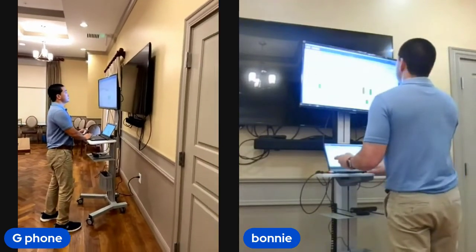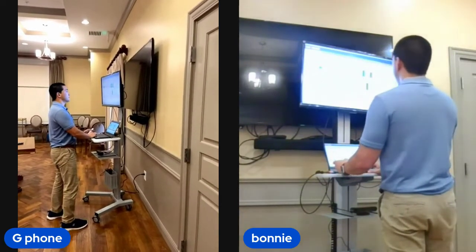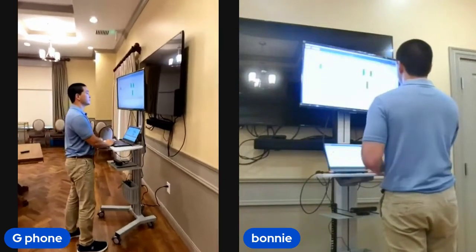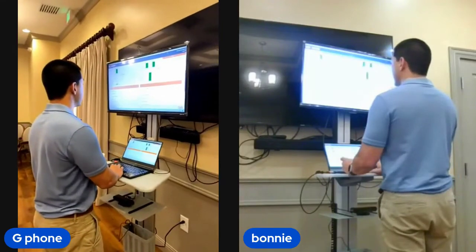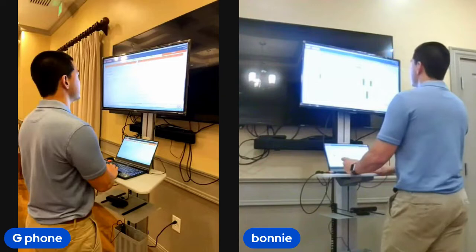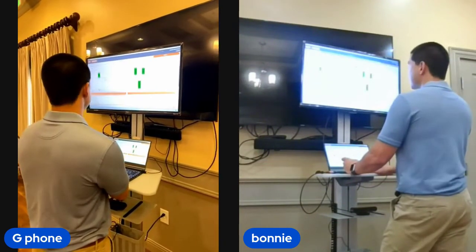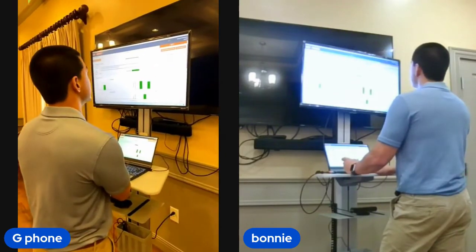Once again, I can make some comments on it, and then it'll give me my gait speed, which is what we look at a lot for fall risk. Then we can also see step length, whether or not I took a really long step with my right versus my left. Also forward lean, if someone's really far on their toes throughout the gait cycle, then you can notice that. If they're below a certain range here, it'll give us a score of their high mobility versus low mobility. And then we can use that as fall predictors. And those are two of our assessments.